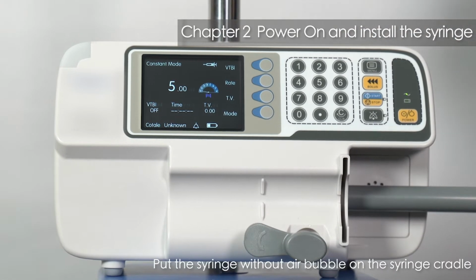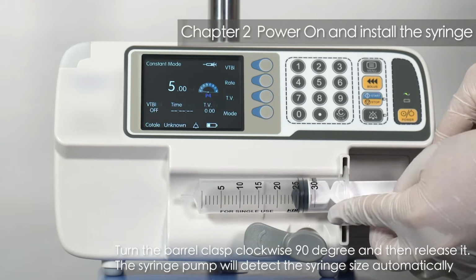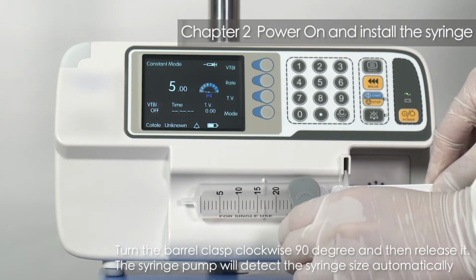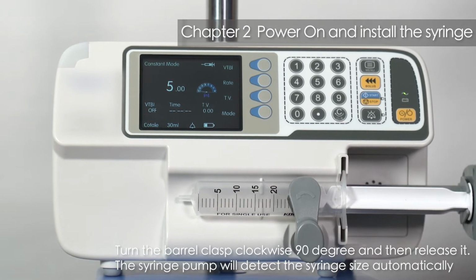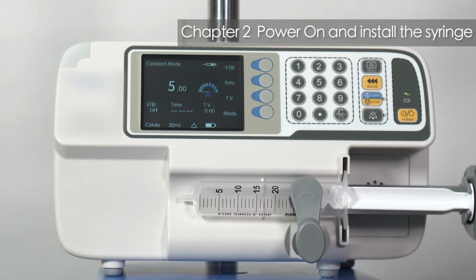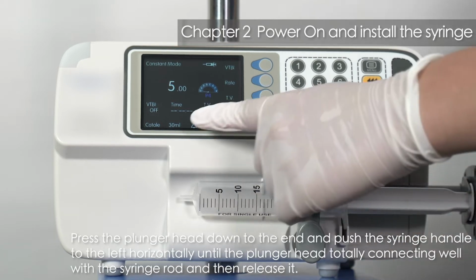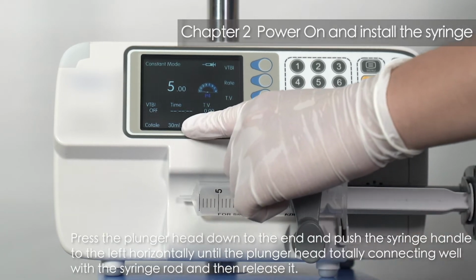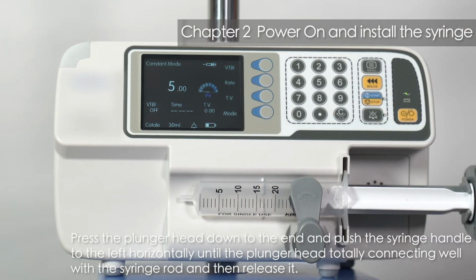Put the syringe without air bubble on the syringe cradle. Turn the barrel clasp clockwise 90 degrees and then release it. The syringe pump will detect the syringe size automatically. Press the plunger head down to the end and push the syringe handle to the left horizontally until the plunger head totally connects well with the syringe rod, and then release it.